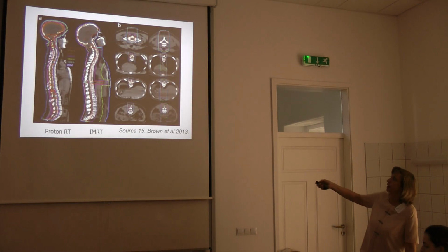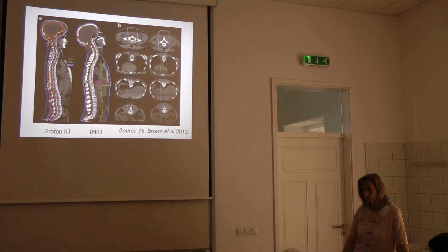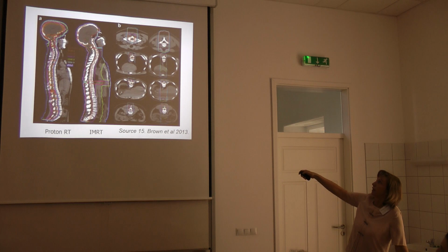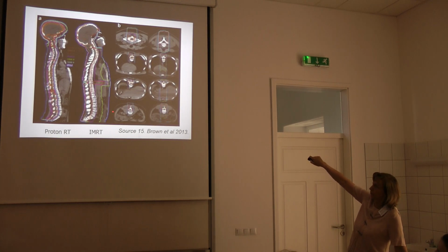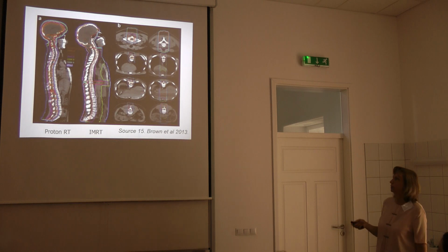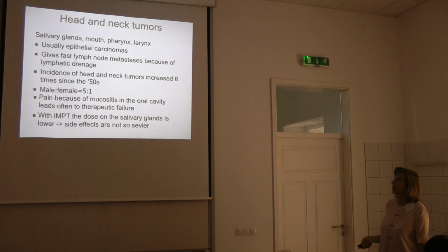This has very high importance because this tumor, this medulloblastoma, which requires the irradiation of the complete brain and spinal cord, the craniospinal axis, is done with a special technique, but nevertheless here in the midline there is a relevant dose absorbed if the best photon therapy is applied, and with proton therapy it could really be tailored and homogenized only where it is necessary, and you can see the comparison of it.